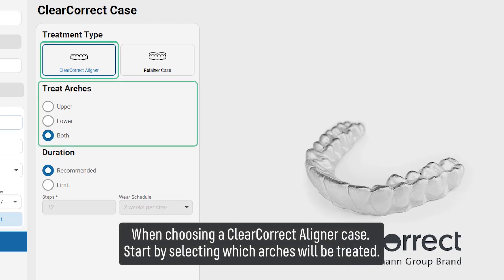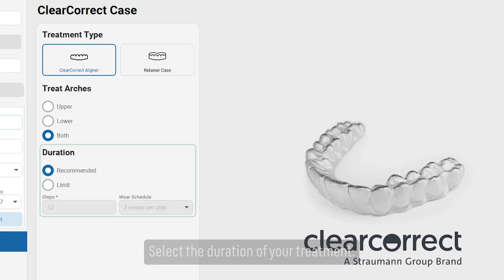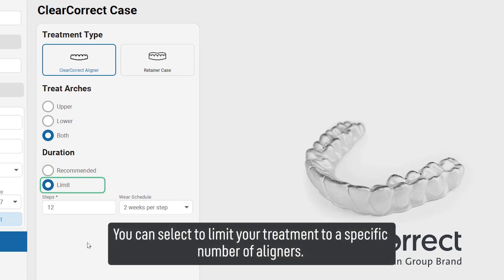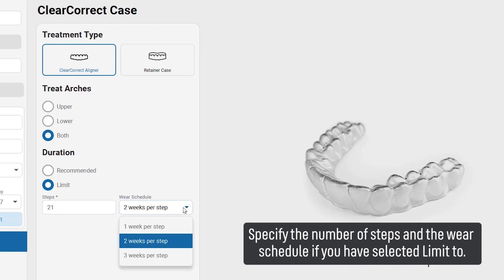When choosing a ClearCorrect aligner case, start by selecting which arches will be treated. Select the duration of your treatment. Selecting 'Recommend' will let ClearCorrect give you their best recommendation regarding the treatment duration. You can also select to limit your treatment to a specific number of aligners, specify the number of steps and the wear schedule if you have selected 'Limit To.'